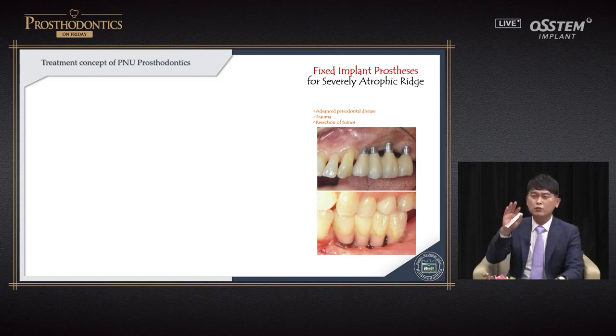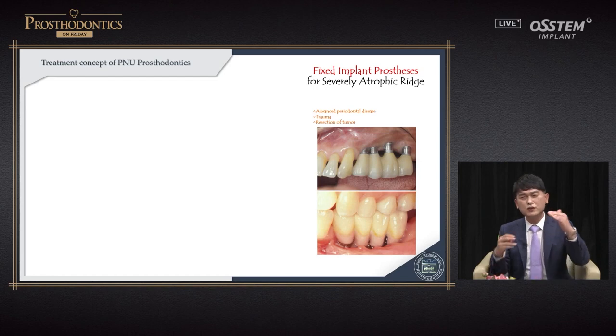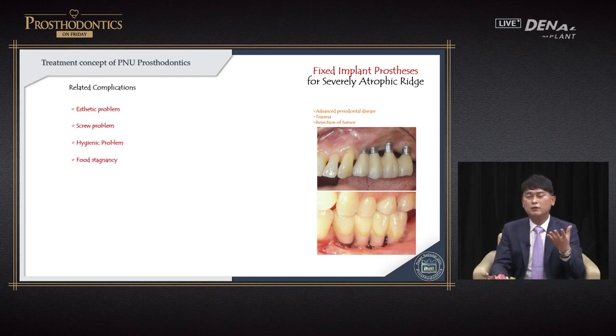This is the picture we had in our prosthodontics classroom. They are not very good. The crowns are too long for ease of cleaning and the holes are too big, and the patient complains of food impaction and sunken cheeks. And if you do it like below, peri-implantitis may occur and it is difficult to use the interdental brush. Can you find a happy medium between these two?